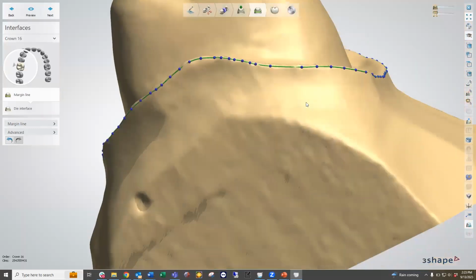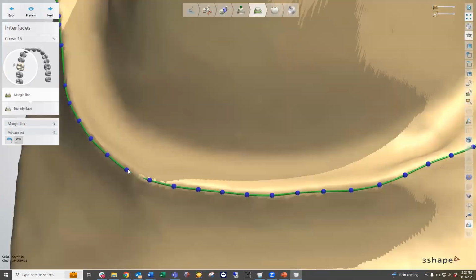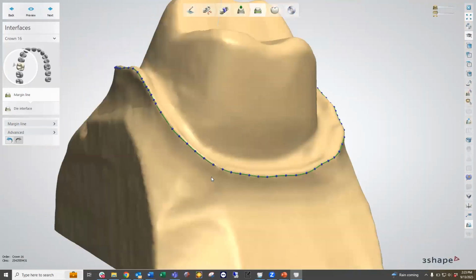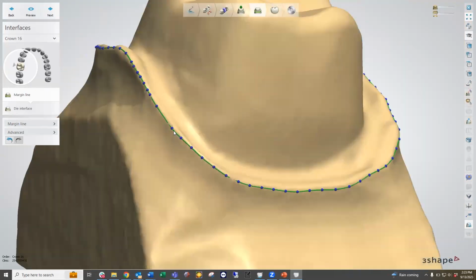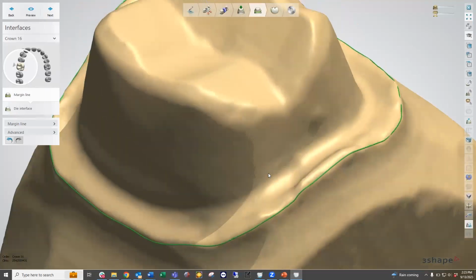Now, when we look at this, we don't want to be overly complicated with this. It's okay to see the lines somewhat go through the model right here. That's typically not an issue. So we're just going to make the changes necessary to adapt it to the right areas. Just make small changes, get this on the height of contour, and then we're going to move forward. So looking at my margin, just going all around again.